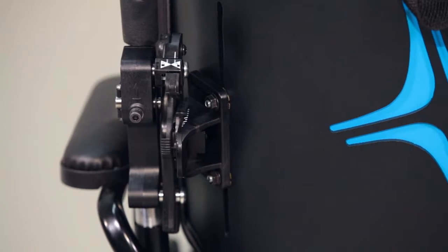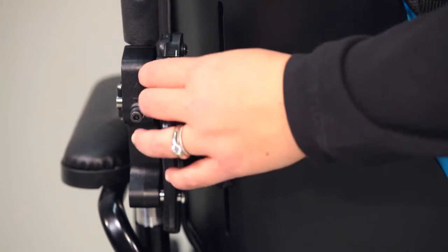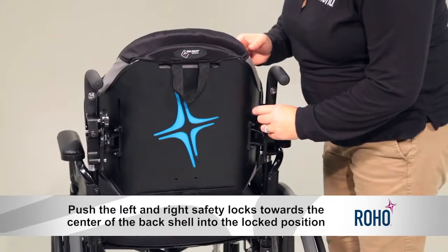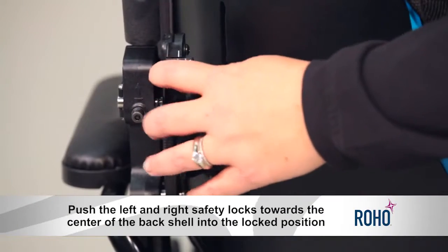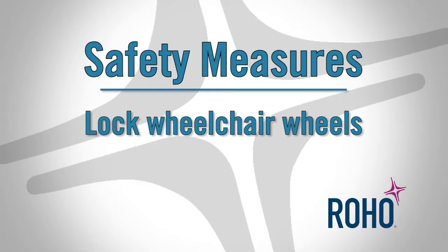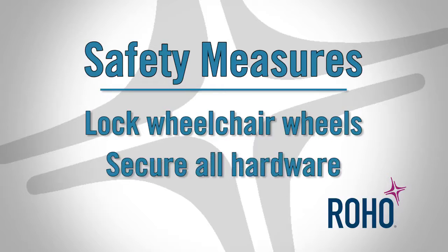pin. Push down on the back shell to ensure the back latches are in place. Make sure both the latches are fully closed. Lock the latches by pushing both the left and right safety locks toward the center of the back shell into the locked position. Make sure the wheelchair wheels are locked and the Agility safety locks are in the locked position, and all hardware is tight before the individual is seated in the chair.